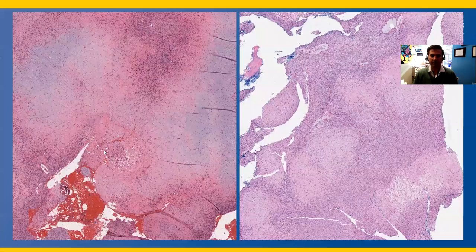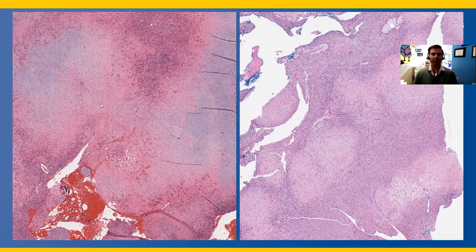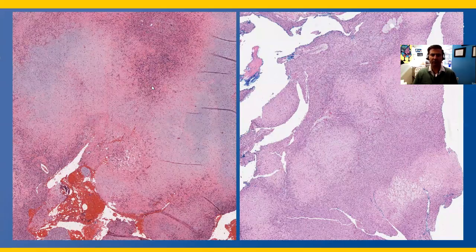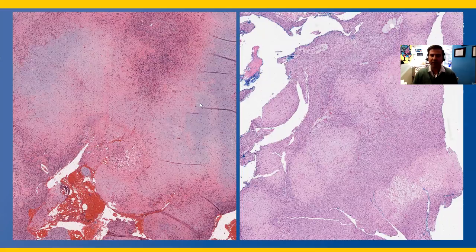Tissue was obtained. Here we have a low-to-intermediate-power lobular architecture with hypocellular areas and condensation around the edges in a really prominent lobular pattern, which is a helpful clue to this diagnosis. The background stroma is chondromyxoid — meaning blue and somewhat fibrous, meaning pink — with this macro-lobular pattern.